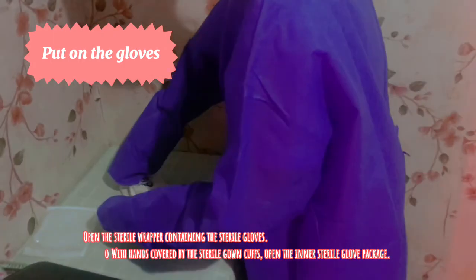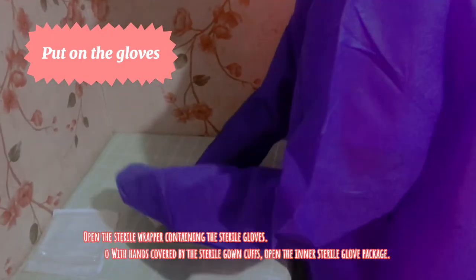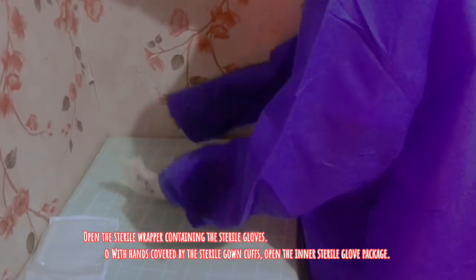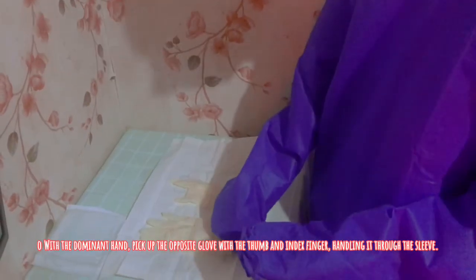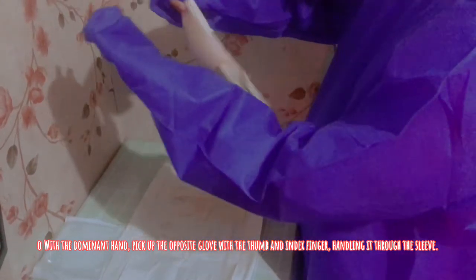Putting on gloves helps prevent contamination or transmission of any foreign droplets or blood to the skin and the patient. Inner sterile gloves are considered sterile and can only be touched by sterile areas or things. Putting gloves first on the non-dominant hand allows easier insertion of the gloves.